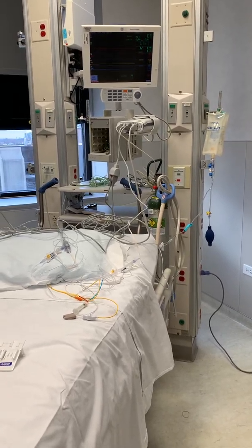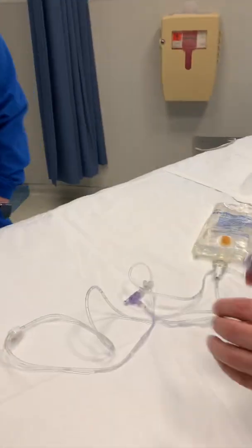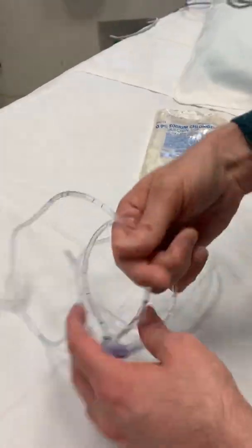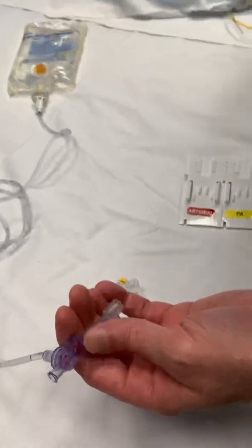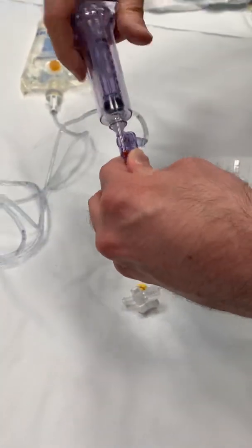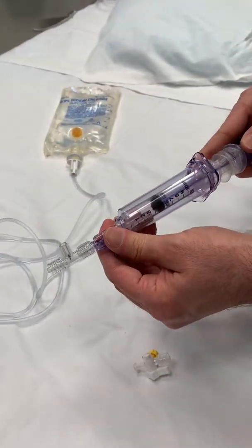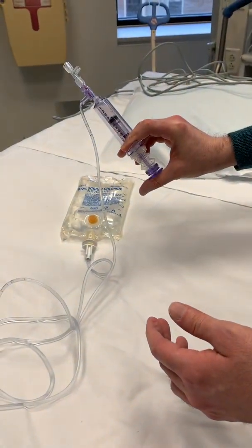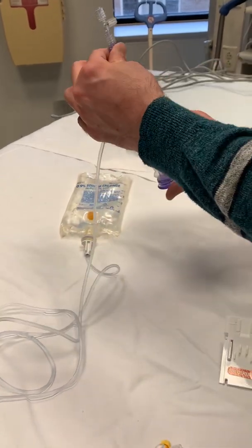Now, setting up our cardiac output. The kit comes in several pieces. You have to get your bag of saline. You get your tubing when you spike it — it looks like this. You've got to connect your syringe; it only connects to one side. Just make sure all these connections are good and tight. This is sort of like a pump — you've got to pull all the air through and get all the air out of this.